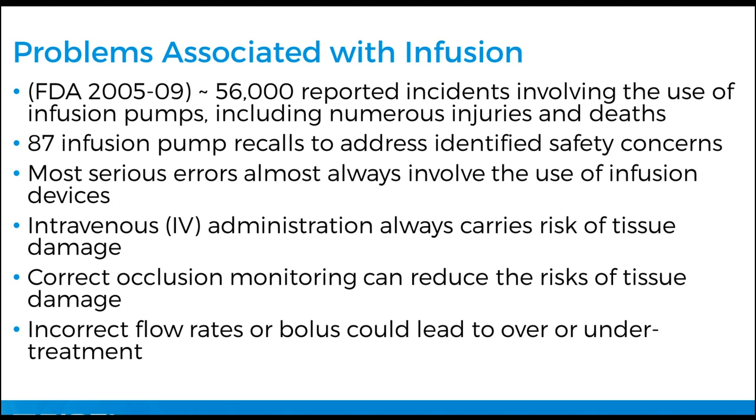So infusion is really common, and because of the massive number of infusion devices out there, because they're the most common device in a hospital, there's going to be errors. Even if it's a small percentage, because of the volume, it's still more significant than many other medical devices. More serious errors are always involved in the use of these infusion devices. So IV administration always carries a risk of tissue damage. Correct occlusion monitoring can reduce the risk of this tissue damage, and incorrect flow rates or bolus can lead to over or under treatment.